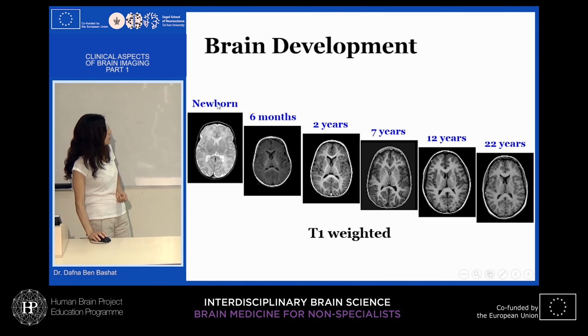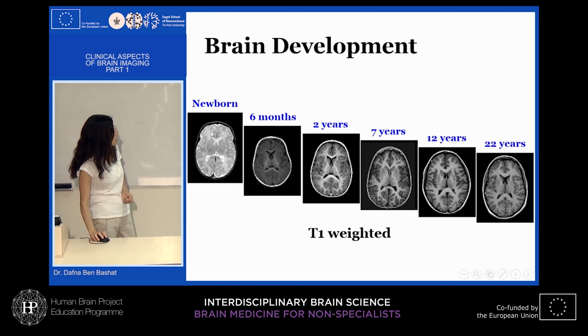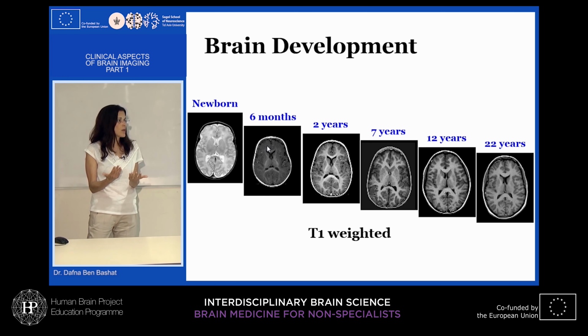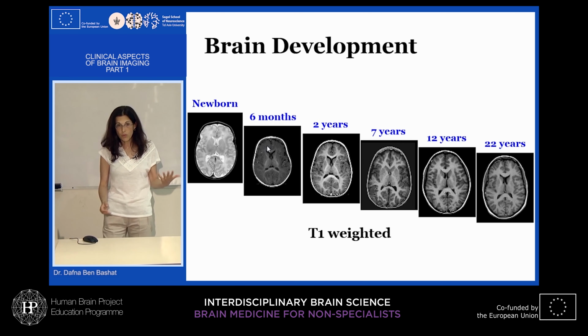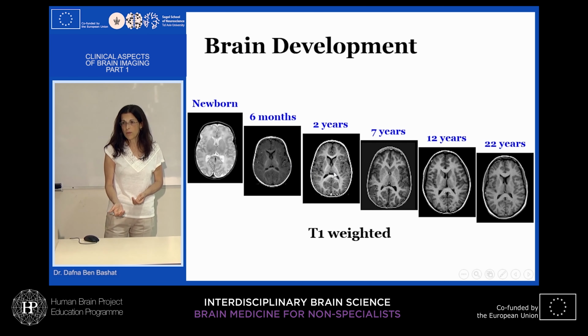So with the T1-weighted image, the contrast of a newborn is really inverted relative to a 2-year-old. During these 2 years, contrast really changes. Around 6 months, we get iso-intense, and we cannot differentiate between gray and white matter. Potentially, looking at those changes, we can learn if there is a problem in development.